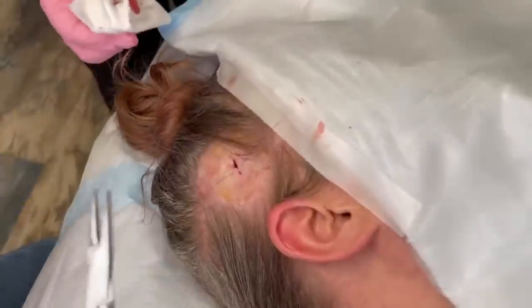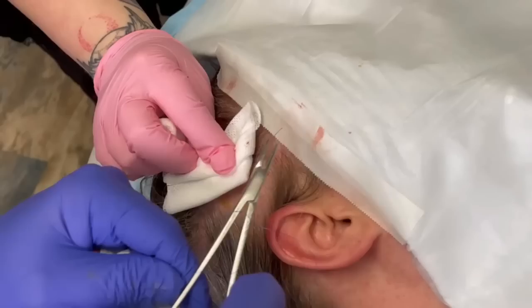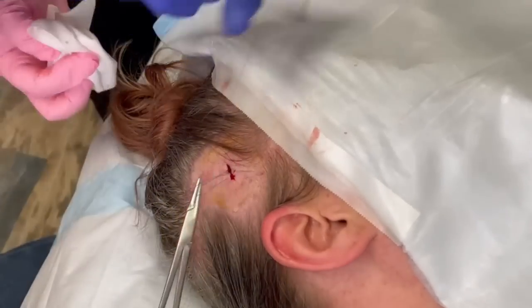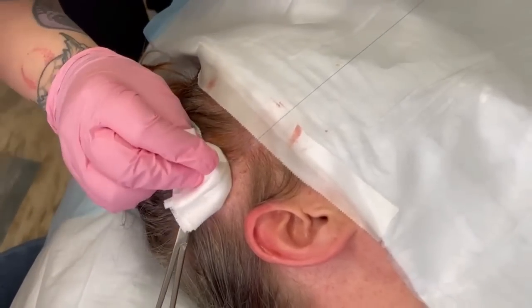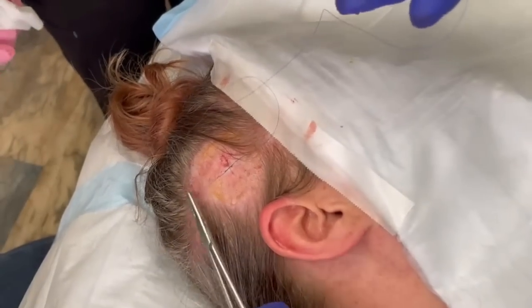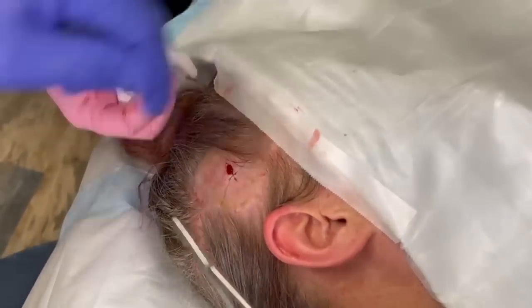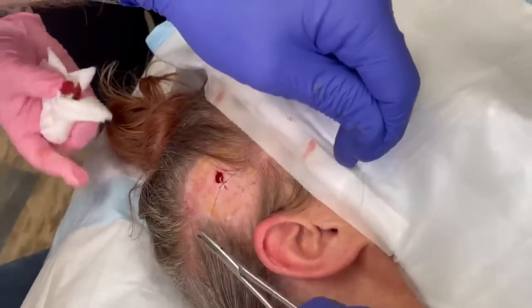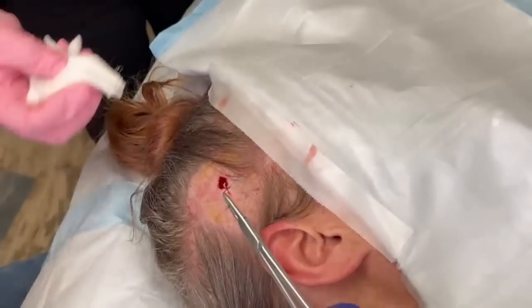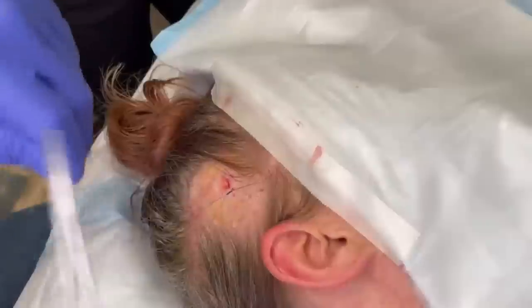Oh, goodness. What color is that blue? Don't we have orange ones? I can't believe they put stitches in colors. Oh, that's right. Okay. Not too tight. We want this to be firm, but, my goodness, you gave me a super long stitch. We want them to be firm, but we don't want them to be too tight, because if they're too tight, then what happens is it sort of crushes the edge of the wound. We don't like that, Jenny.